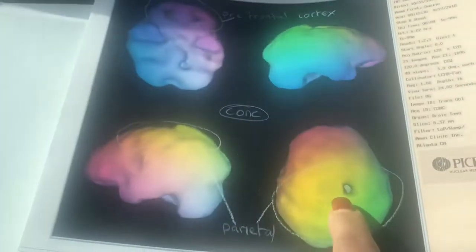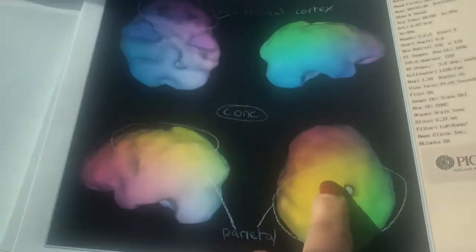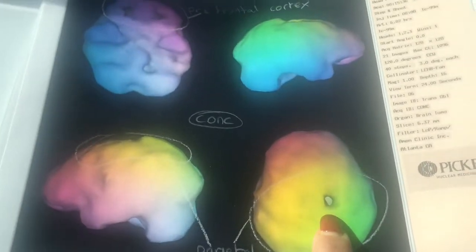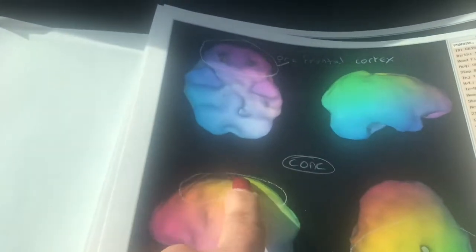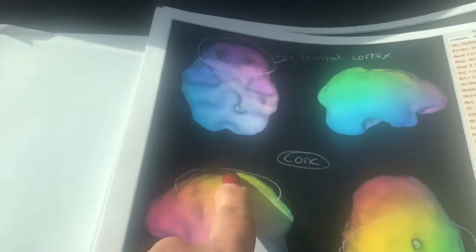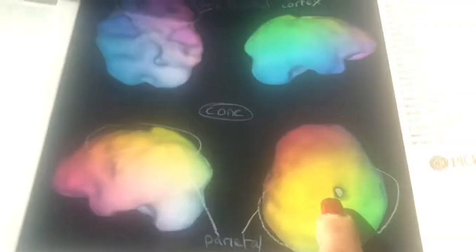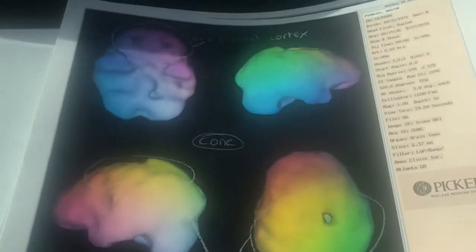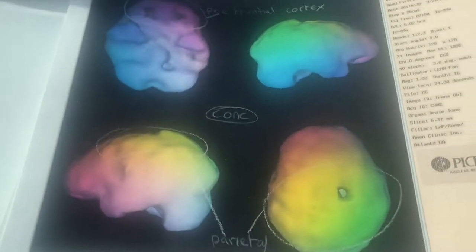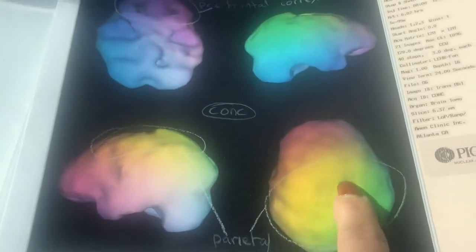Right here on the parietal, this is a sign of brain injury. So on the top of my head, there's a significant hole, and you can see it up here from the side view. That big indentation—there's actually a hole in my brain as if I suffered a brain injury.